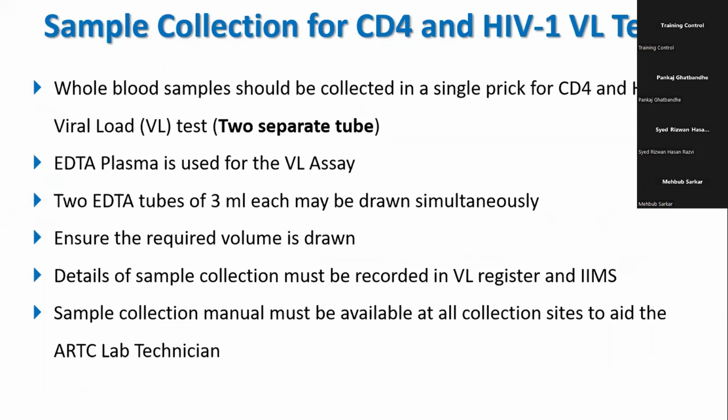Details of sample collection should be recorded in the viral load lab register, as well as entered in SOCH. I hope all the ART centers are maintaining the viral load lab register. If you have not maintained it, please make sure you maintain these viral load lab registers, and make entries of each and every day on that particular day, as well as do SOCH entries.